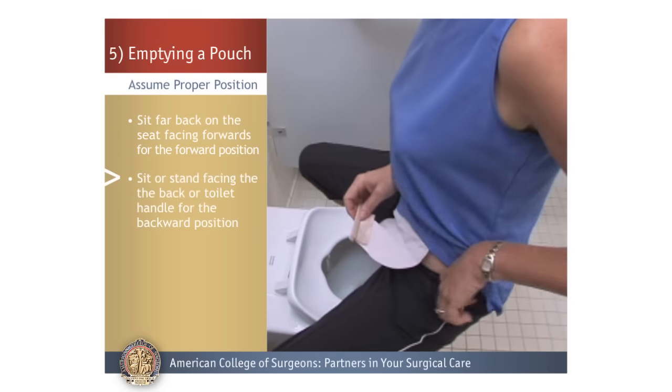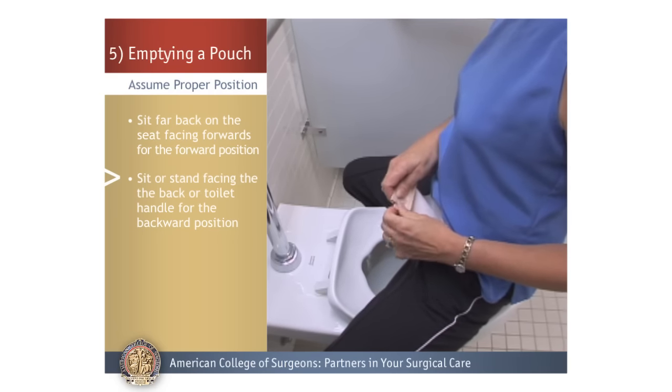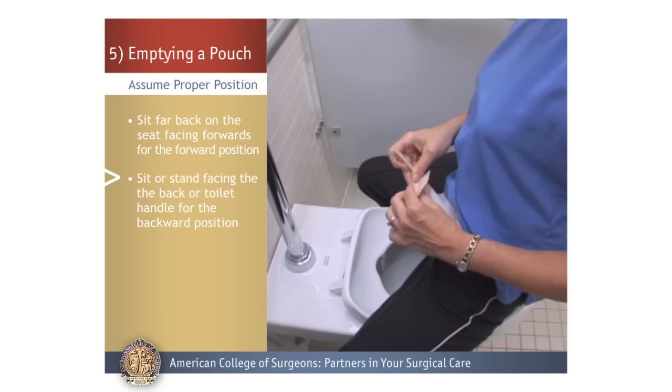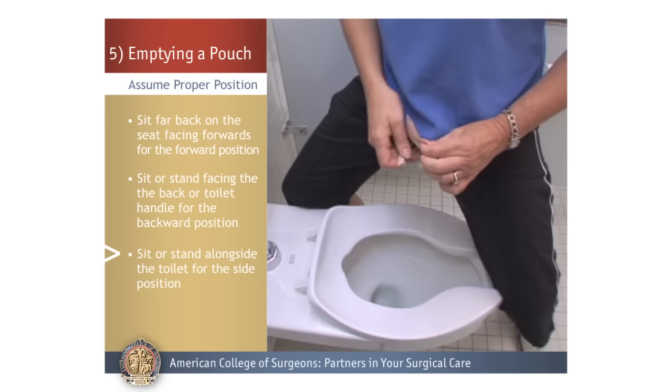For the backward position, sit or stand facing the back or toilet handle. For the side position, sit or stand alongside the toilet.